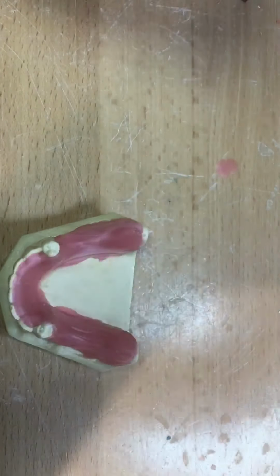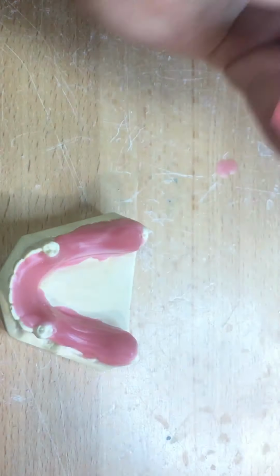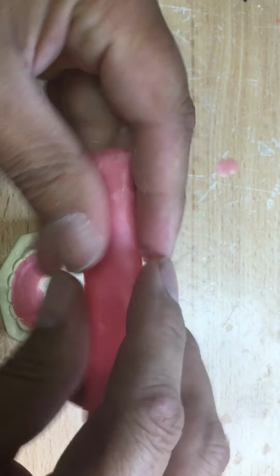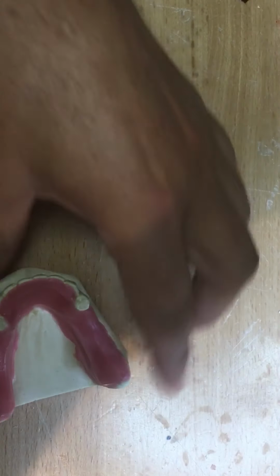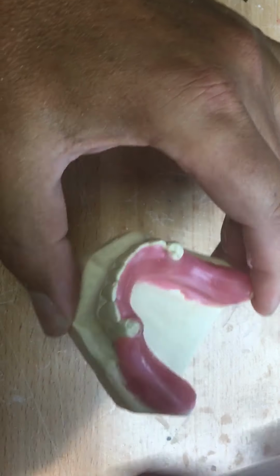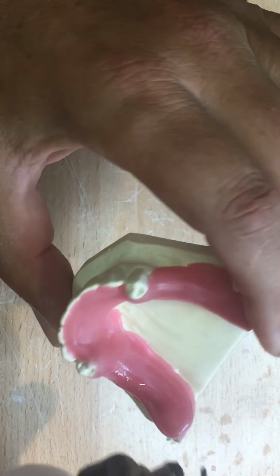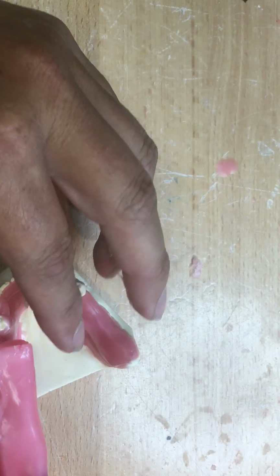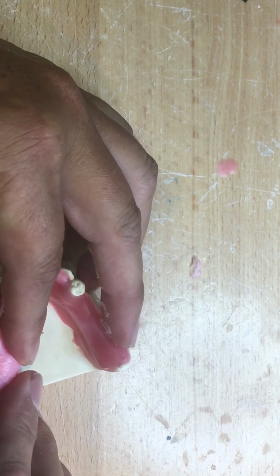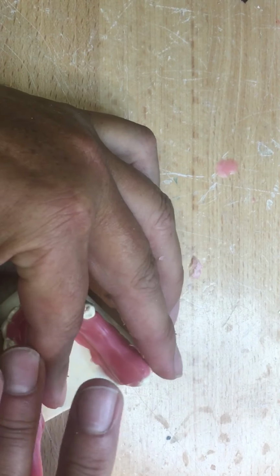So I free-flowed wax all towards the extensions of the base plate. Then I'll go and roll up some base plate wax to express all the air out. I'm going to heat up the wax on the model first, as you can see, because obviously cold wax is not going to become homogeneous with hot wax at once. They both got to be roughly the same temperature. And then I'm going to go and apply the base plate wax.